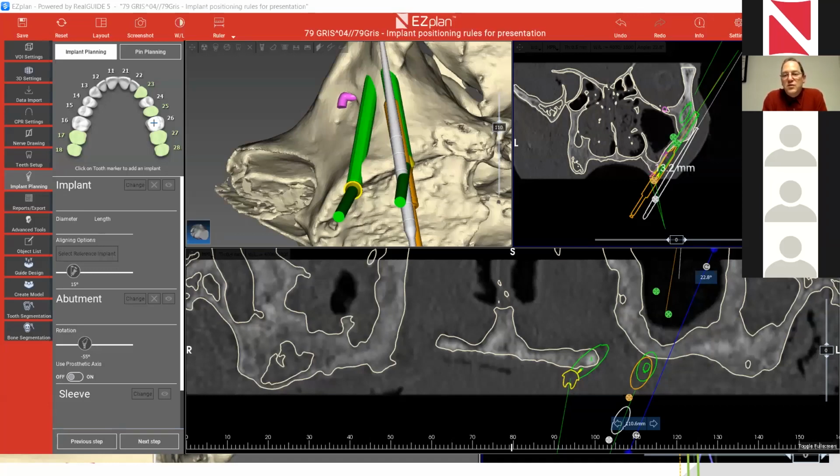So with the zygomatic guidance process, we can bring the multi-units to the position and the angulation correct so that you can put the restoration. I hope to see you on Monday and you'll see the trick.